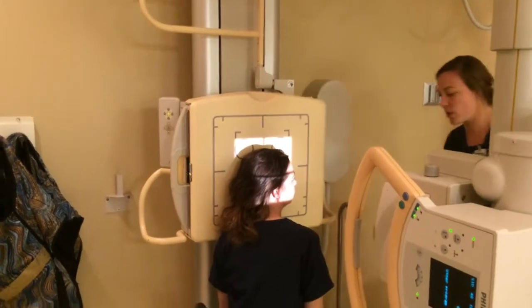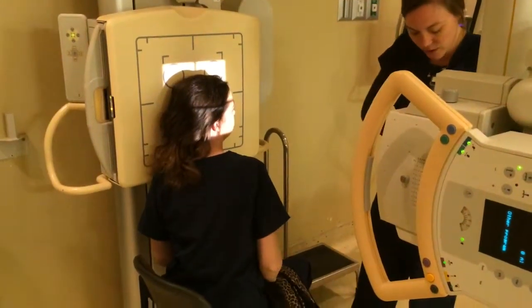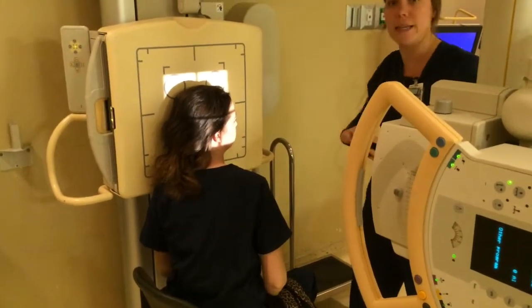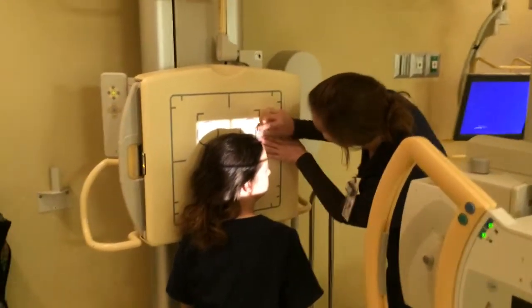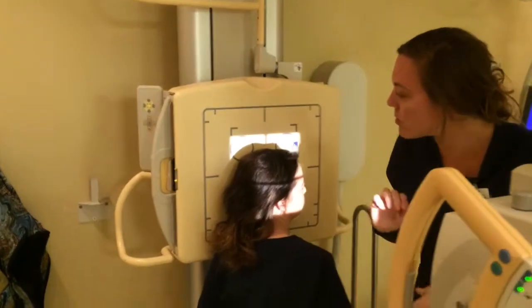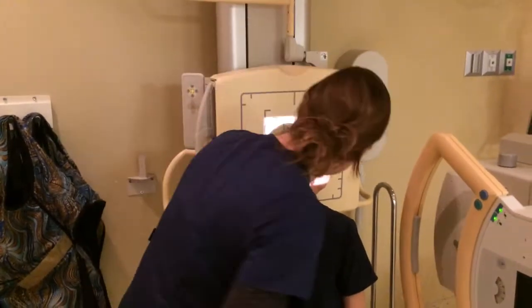I'm going to shield my patient, and we're also going to use a left marker to indicate that the patient's left side is on the IR. We also just make sure that we have the entire skull in the light field.